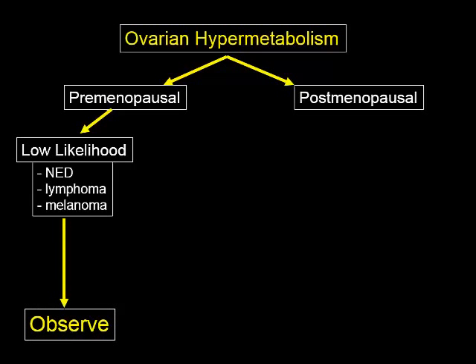Now, we do have the privilege at MD Anderson that many of our patients do come back on a fairly regular basis, and so we're not so concerned about them disappearing and never being seen again. We know that we will see that patient again in 3 months, 6 months, at some point in the future, so we can put them on an observation and merely see what that activity looks like.